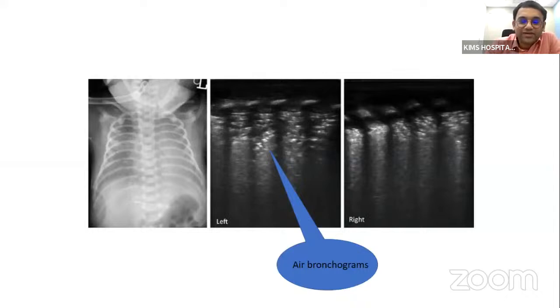Identification of respiratory distress in extreme preterms or very preterms may not be that difficult because we have the setting, we have an X-ray. But identifying RDS and differentiating it from TTN is needed, especially in late preterms, where both conditions usually mimic each other. So in the late preterms and early terms, we can use lung ultrasonography to identify whether the baby has RDS or TTN, so that we can decide about surfactant or about providing higher pressures.